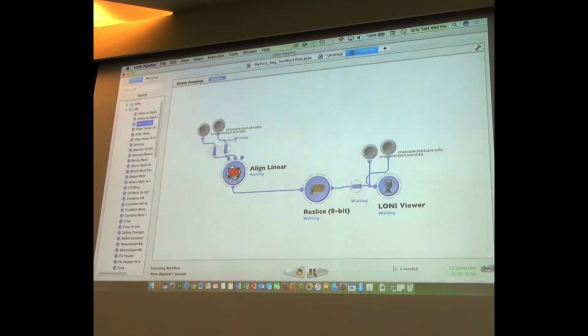Yeah, and this pipeline we use to pre-process your images. Okay, yeah, I'll show you examples. My point right now is to show you the working of the environment, and then I'm going to show you specific protocols for pre-processing, segmentation, parcellation, and all kinds of other things. And all you need to do is just to load the MRI.